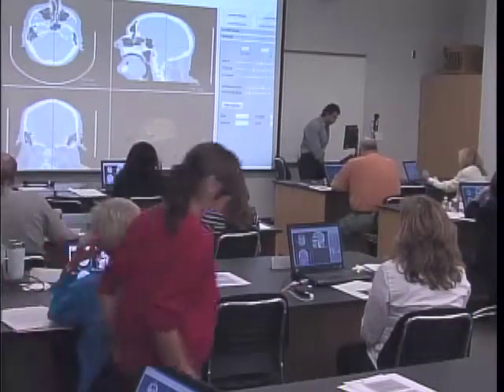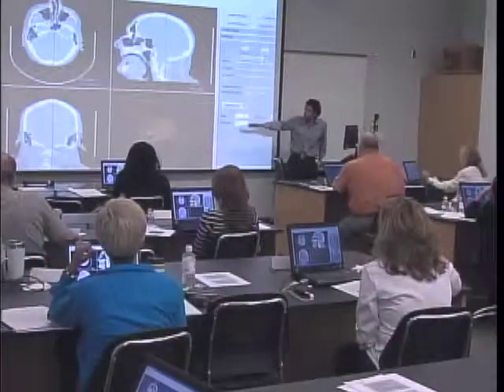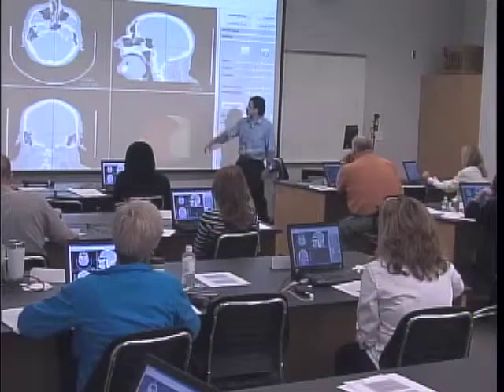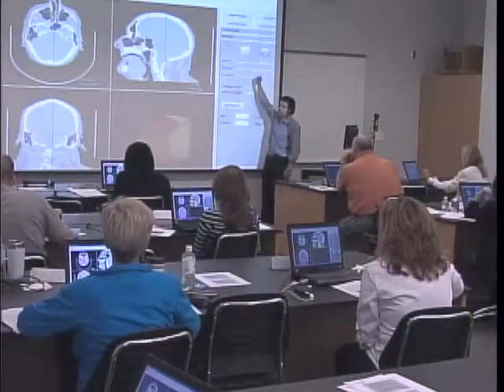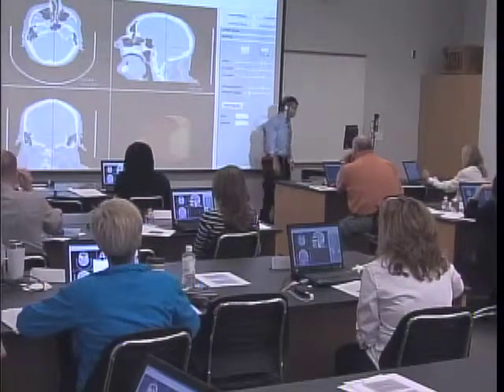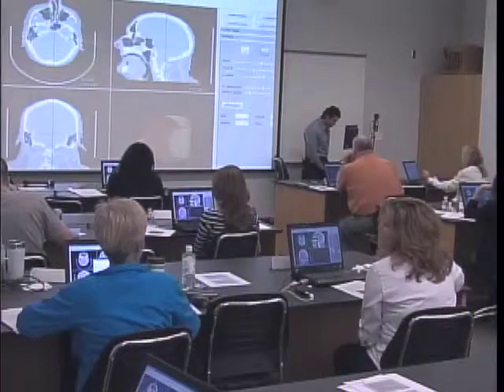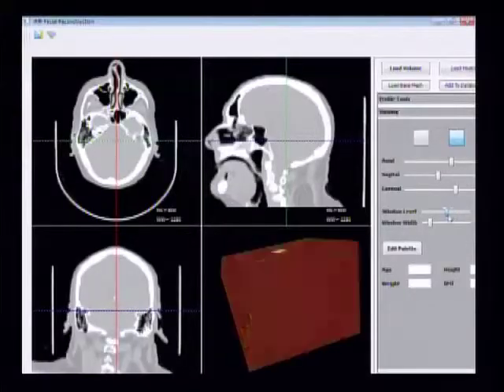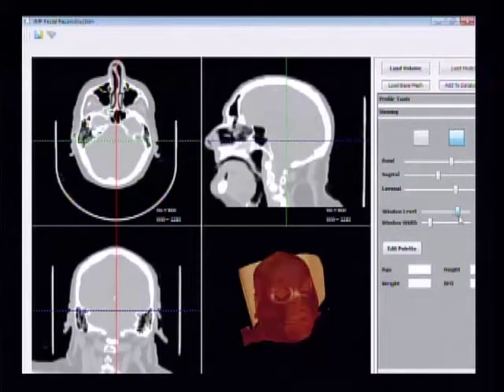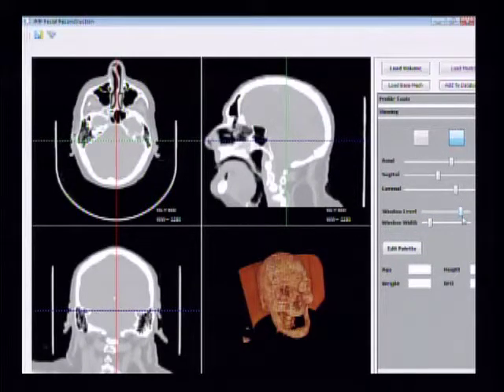If you click on the other button here, that switches from this mode of rendering to another mode of rendering that we call surface volume rendering. So everyone, if you click on the button up there. Okay, what you see here is actually a volume render of the CT volume. If you put it all the way, what you see is only a block. If you keep moving, you get rid of the soft tissues, and you can see the bone. So that's the effect of the window level we spoke about before.